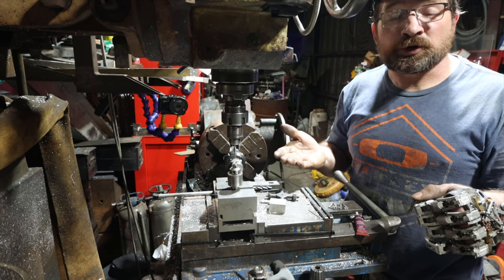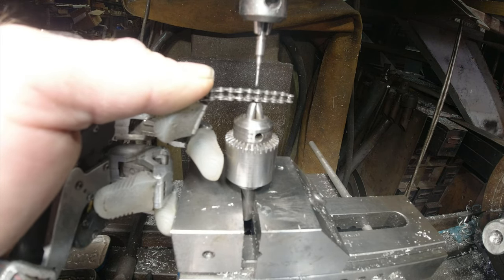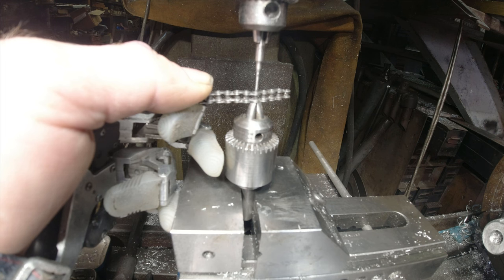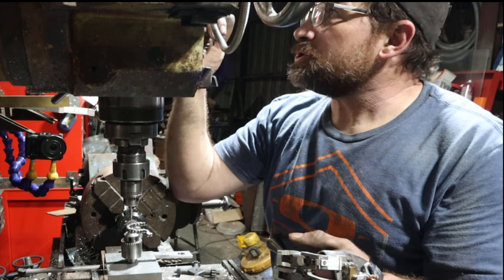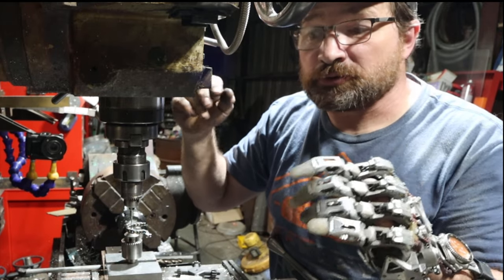Next you need to figure out where you want to break the chain and line up that rivet in the bottom drill chuck. From there, line everything up with your punch, then gently start pushing the rivet through the link. Once you get the initial break, look over at your DRO and get it to where it's five or ten thousandths proud of your zero number.